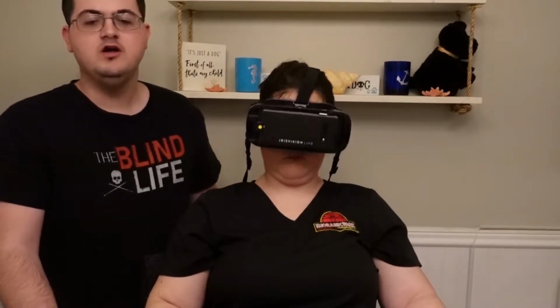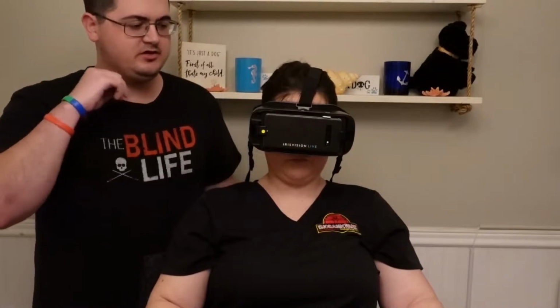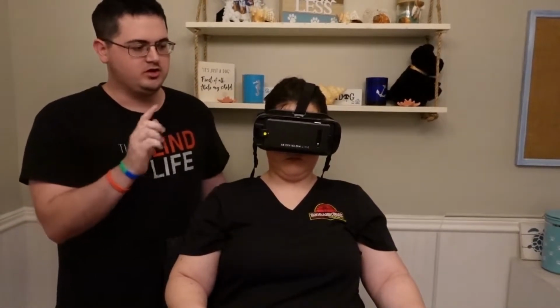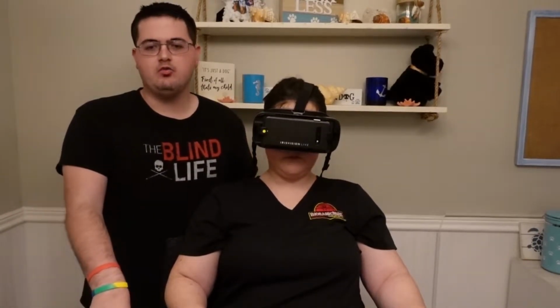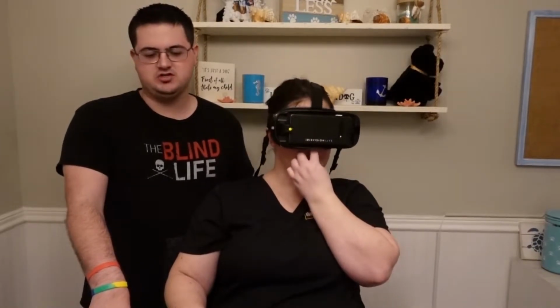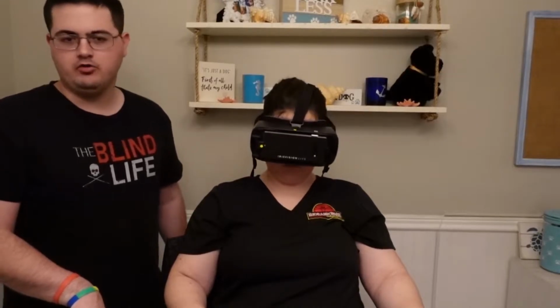That was a basic demonstration of what happens. When you double tap it, if you've ever used VoiceOver, it's very similar to giving it voice commands like you would with VoiceOver. When you do the double tap, it's listening. Then you can tell it what mode you want to be in, as well as the zoom and magnification. So we changed it to scene mode, so now we are in a different mode.